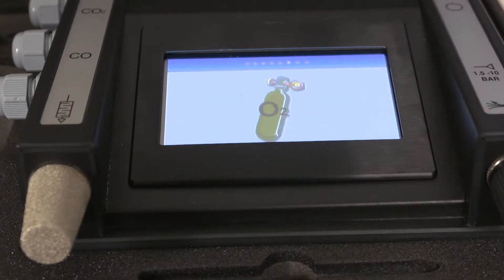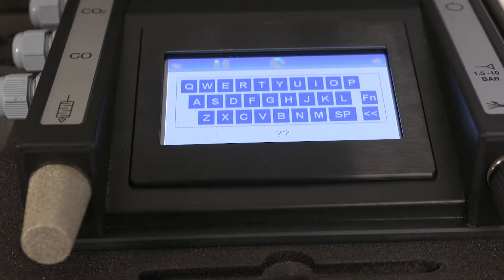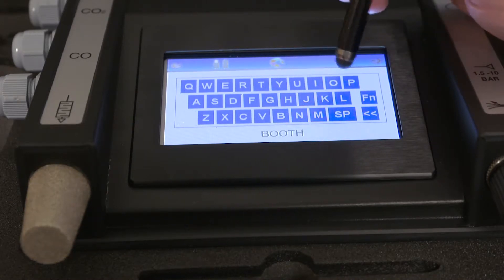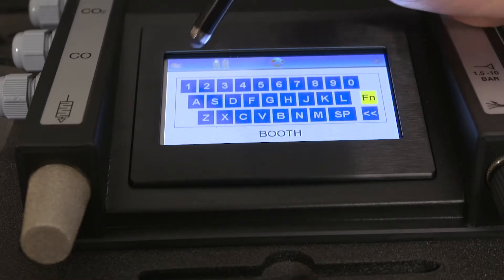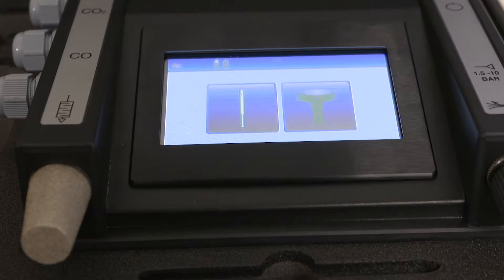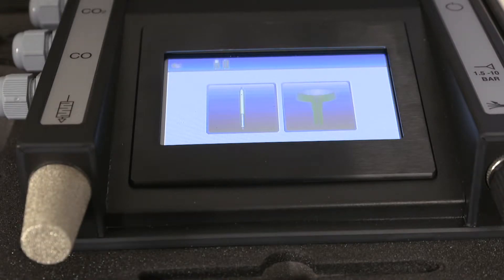The unit will then automatically calibrate the oxygen cell against the surrounding atmosphere, so the unit needs to be in a well ventilated area. You now have the option of entering a description for the test location. If you wish to use numbers, press the function button. Push the right arrow button when you're ready to proceed. Select oil type — impactor or oil mist.